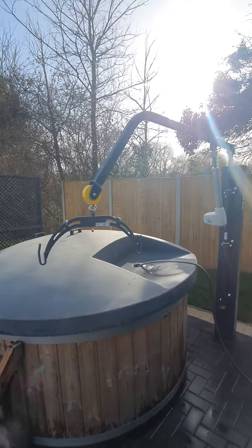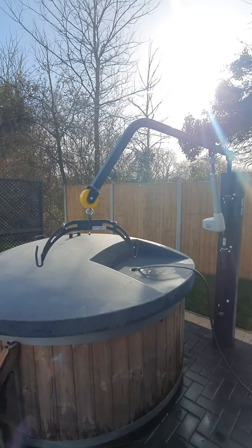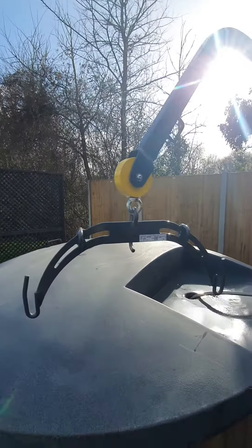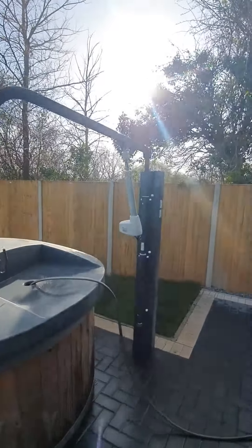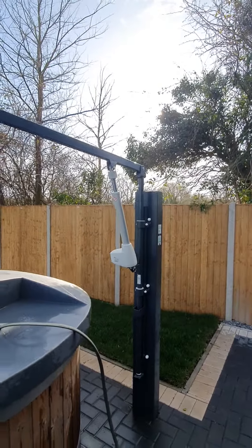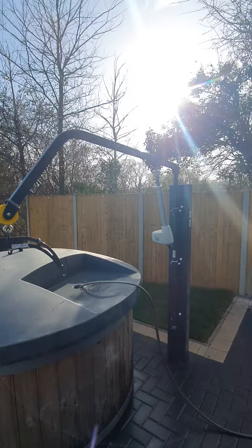I'm just going to give you a really quick demo of setting up the hot tub hoist when you first arrive. The arm which the sling attaches to will be inside, and the powered part at the end — this bit will be fitted with the battery pack on charge inside the kitchen.